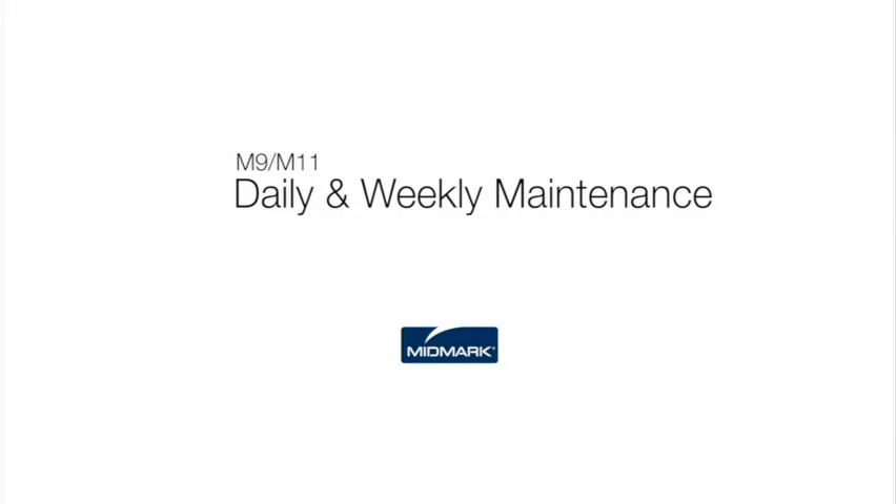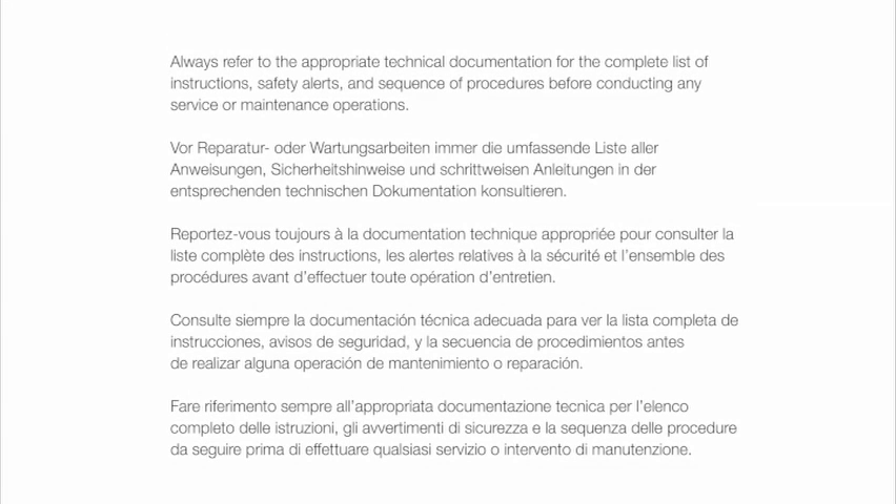This video is an overview of the daily and weekly maintenance of your autoclave. Always refer to the appropriate technical documentation for the complete list of instructions, safety alerts and sequence of procedures before conducting any service or maintenance operations.